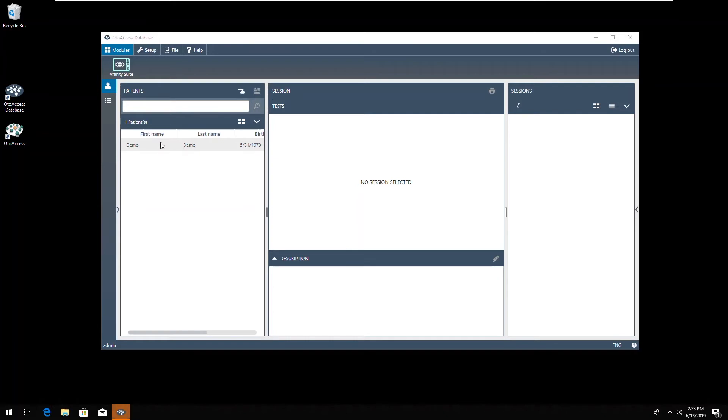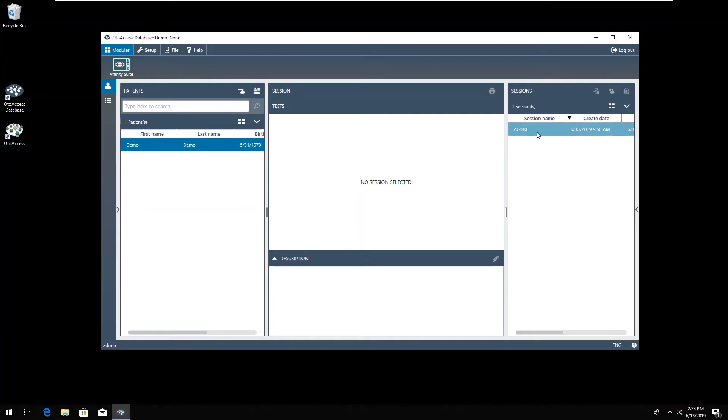Let's open AutoAccess database to see if we have imported the patient correctly and the session. And as you can see, we have the patient and we have the session.